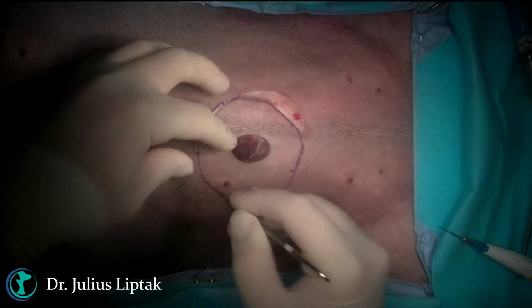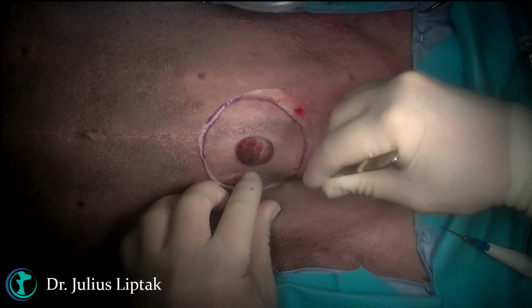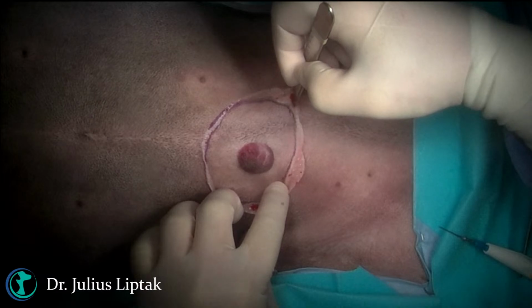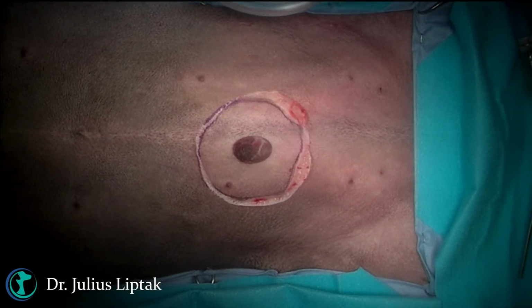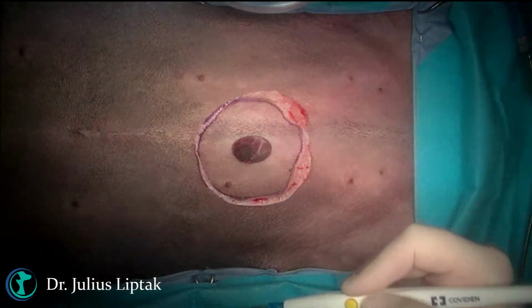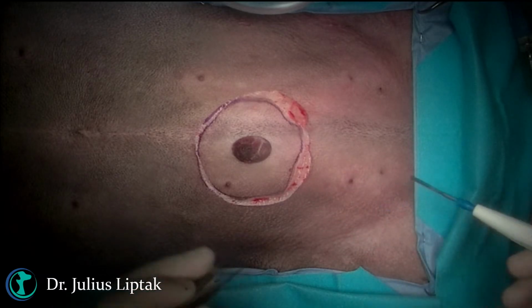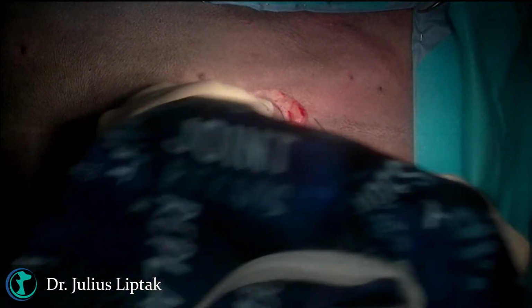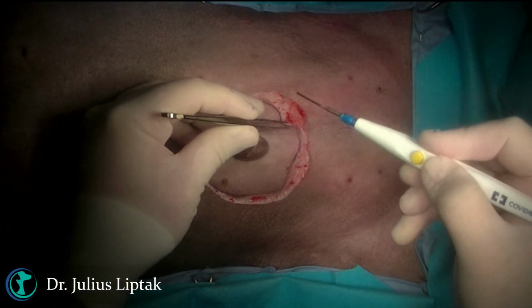So then just incise along those lateral margins. And the marked margins kind of keep us on the straight and narrow. We're not going to be worried about closure until we actually remove it. Can I have the cautery plugged in? Thanks. Here we go.